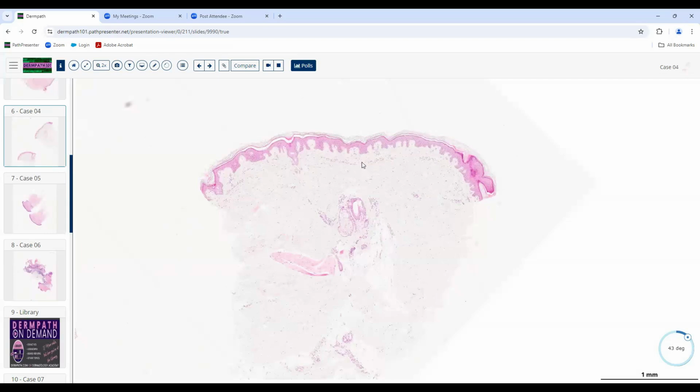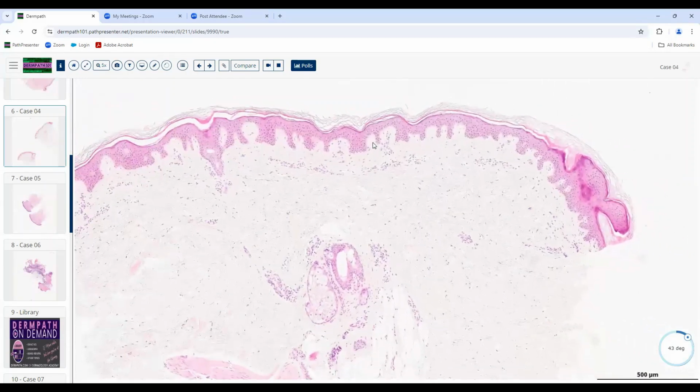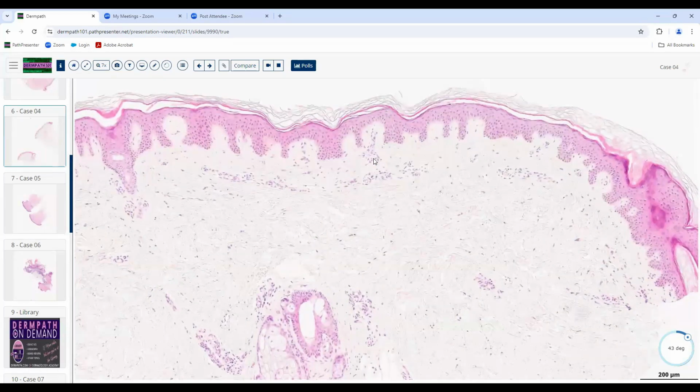Whenever we see something like that, we say, well, that's not normal. Normally the epidermal rete ridges and the dermal papillae are really quite thin. They're not this bulbous, and they're not this expansile. So it makes us think that there's something pathologic in the papillary dermis. That should be a clue when you see that at low magnification. There's not a whole lot of diseases that really affect the papillary dermis in that fashion. Non-bullous lesions of porphyria can do that sometimes. When they get the blistering, they get the festooning because you get the blood vessels that have the thick PAS positive material around them. You can see it in lichen nitidus, where you get little collections of histiocytes in those dermal papillae that expand them, and you get kind of a ball and claw morphology.